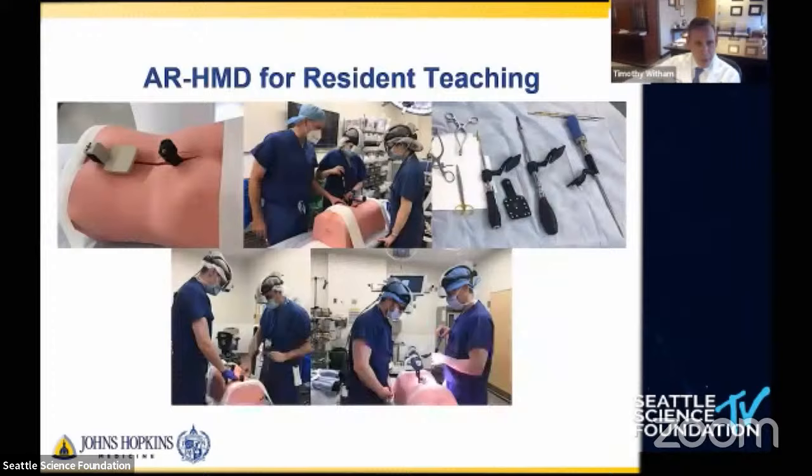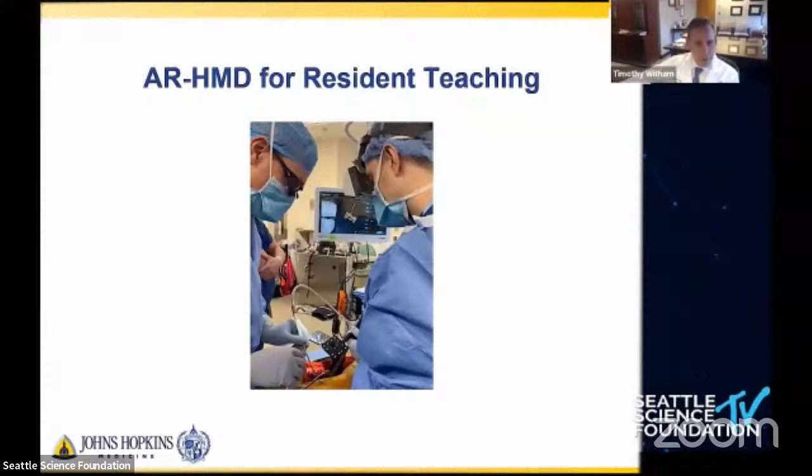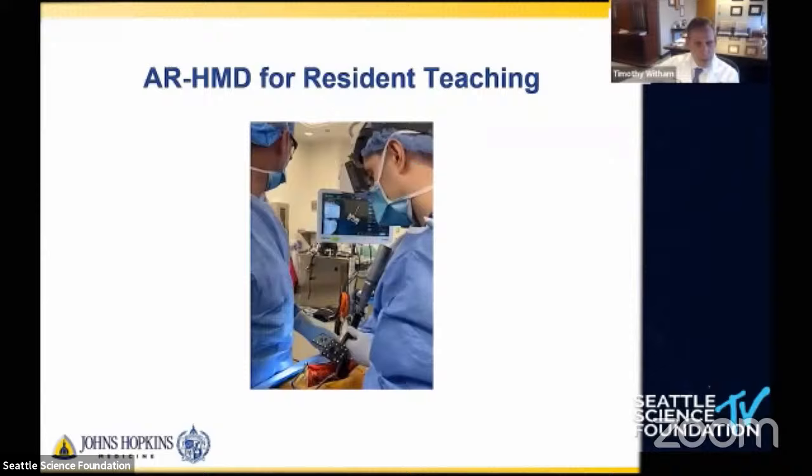It's been a great tool for resident education and teaching. I usually have them work on a sawbones type model before they try it out in the OR. But for this, there's a video here. I don't even have the headset on.